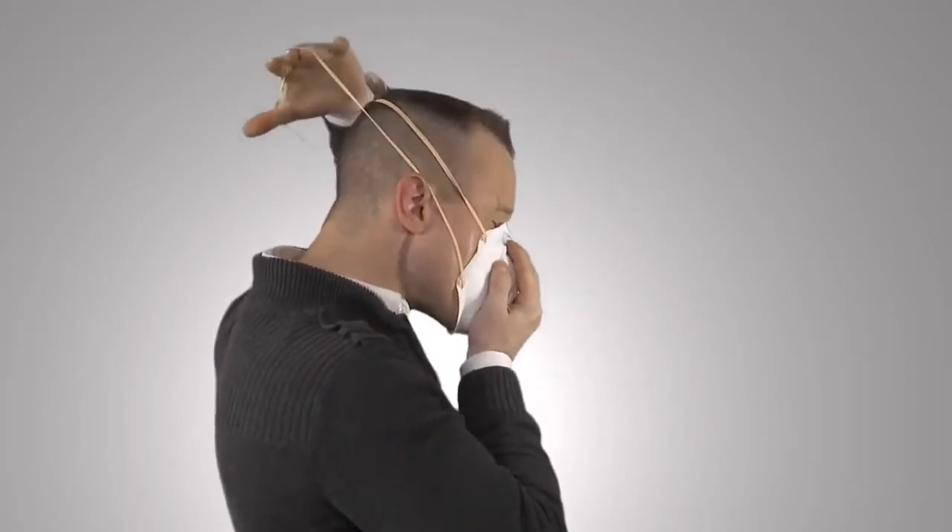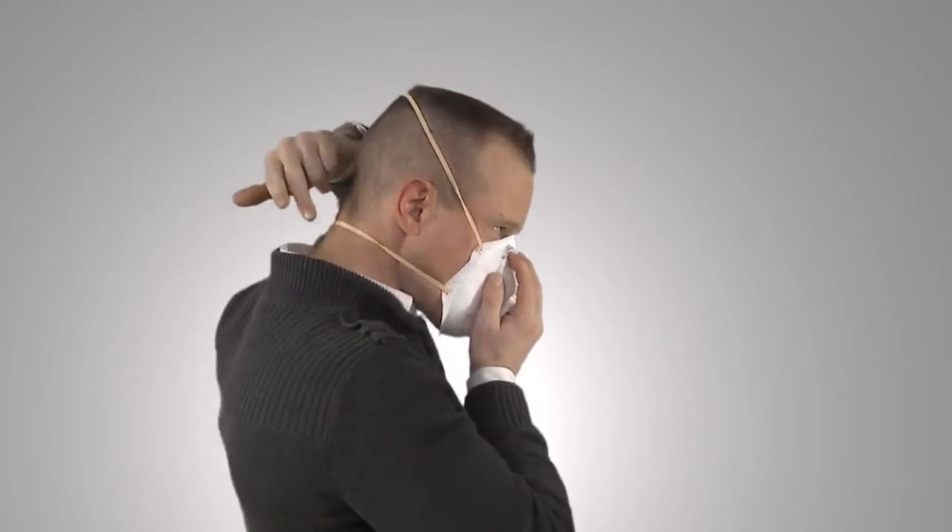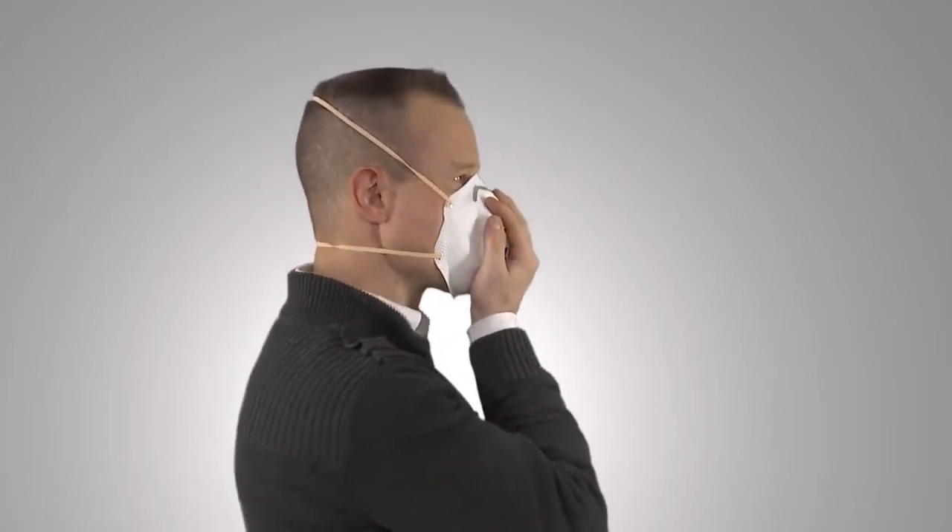Pull the top strap over your head until it rests on the crown of your head above your ears. Third, pull the bottom strap over your head and place it on the back of your neck so it rests just below your ears. Fourth, using both hands and starting at the top of the nose clip, mold the metal nose clip around your nose to achieve a secure seal.